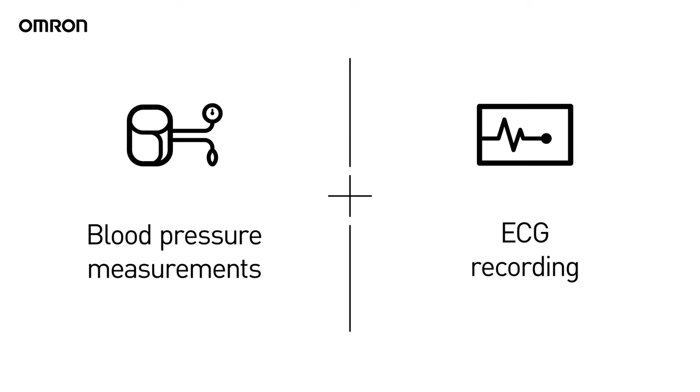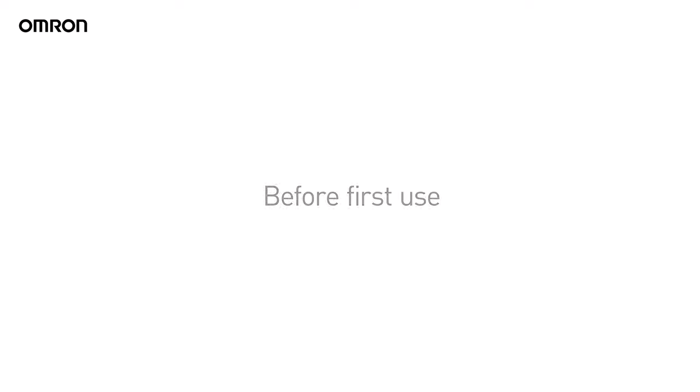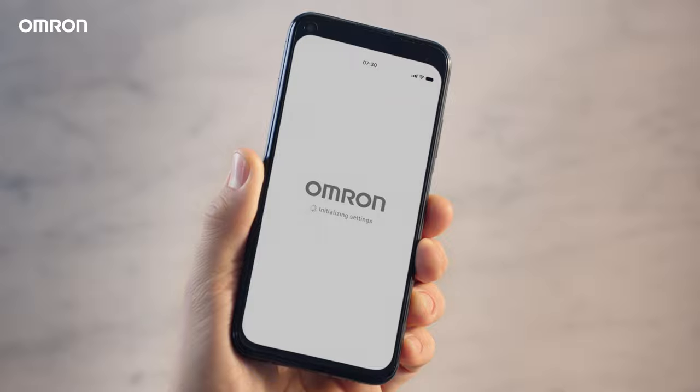Blood pressure measurements and ECG? Meet Omron Complete. Here's how you do it. Before first use, install the Omron Connect app on your smartphone.